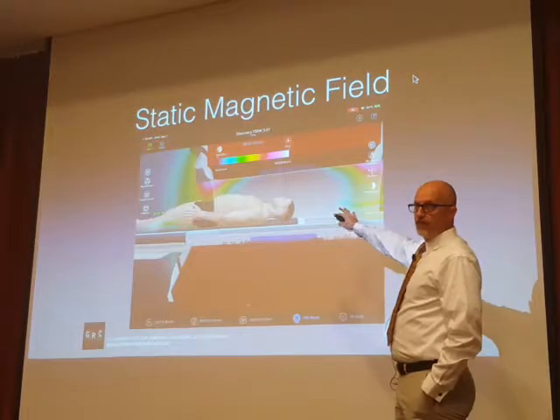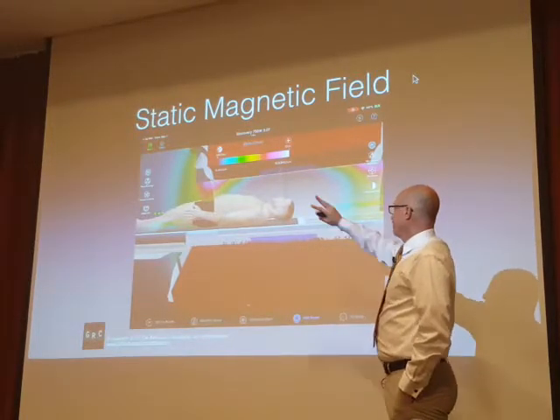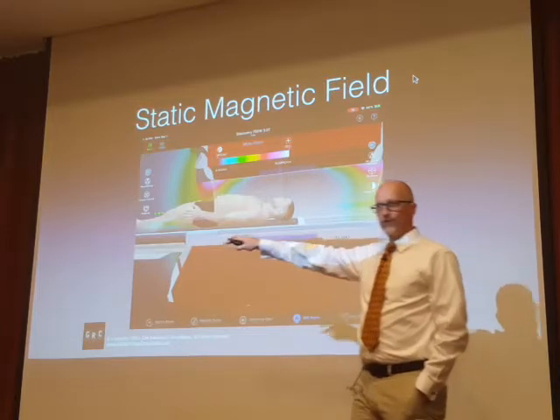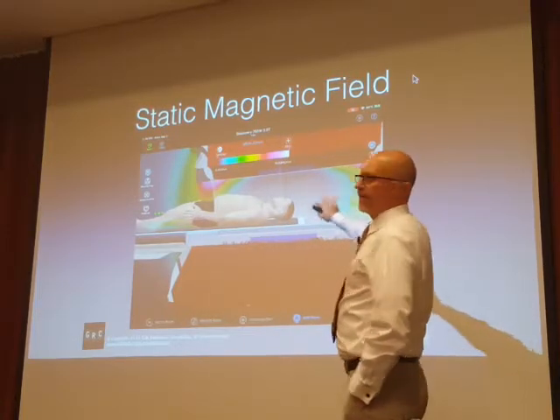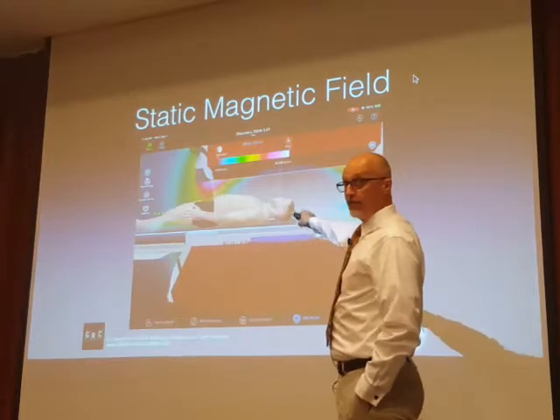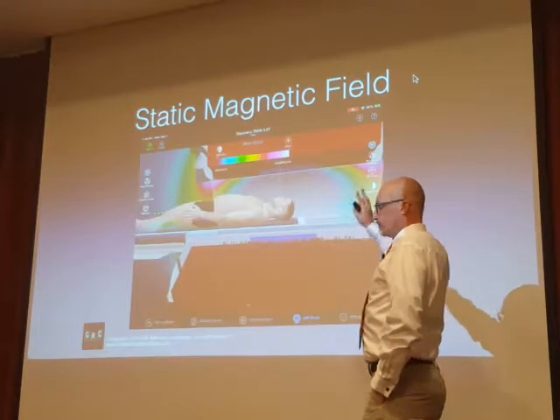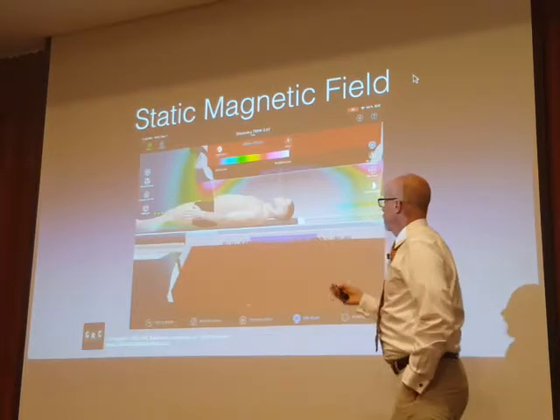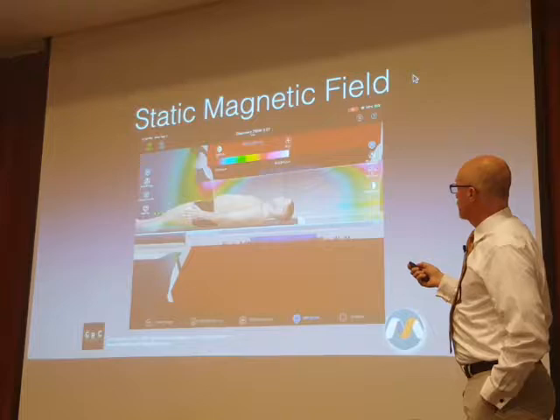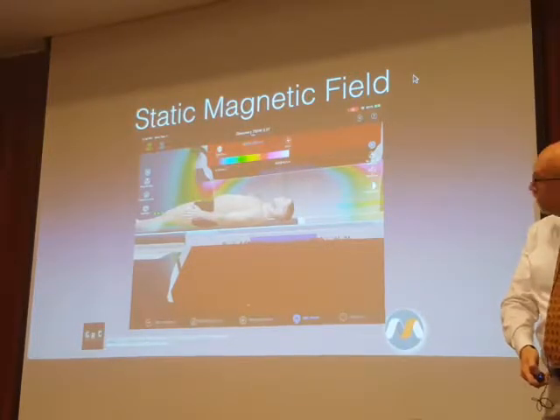These illustrations come from Magnet Vision. Magnet Vision has, in the current version, almost every one of the GE magnet systems, and it has the full three-dimensional modeling of static field, spatial gradient, and the others, and we'll take a look at those next. Come down, there you go.